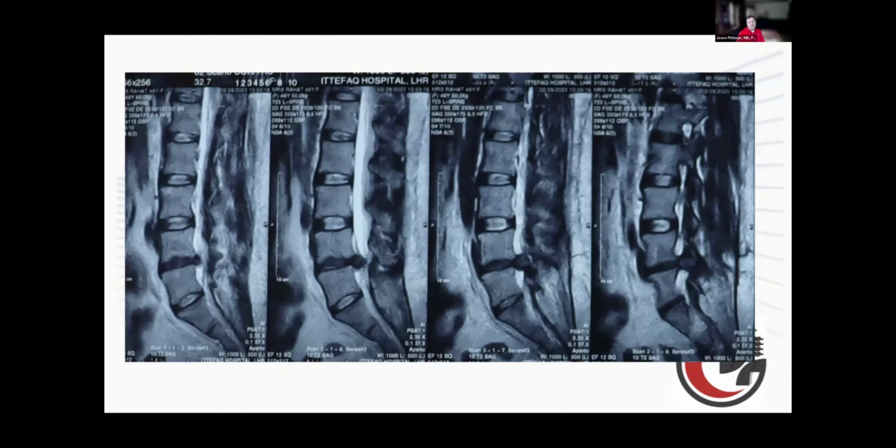over open. And then with regards to revision discectomies, I love minimally invasive approaches because it is easier for me to get through the scar tissue and identify the previous surgical bed without the concern of falling into it accidentally during my approach.